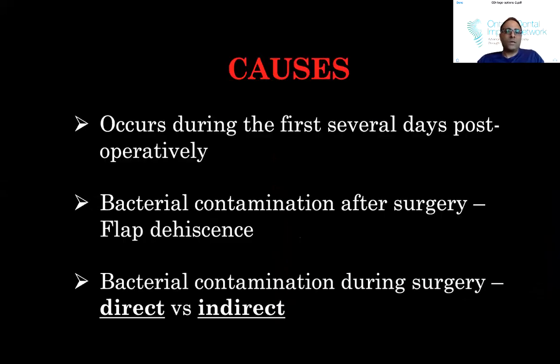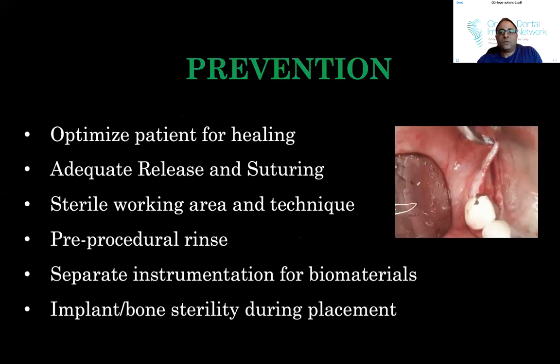So what are the causes? Well, typically this infection will happen during the first several days or weeks of the surgery. You get bacterial contamination, normally because of the flap opening, and/or it could also be because there was bacteria in the site, whether directly when you were doing the surgery, or indirectly as a result of the flap opening. So how do we prevent it?